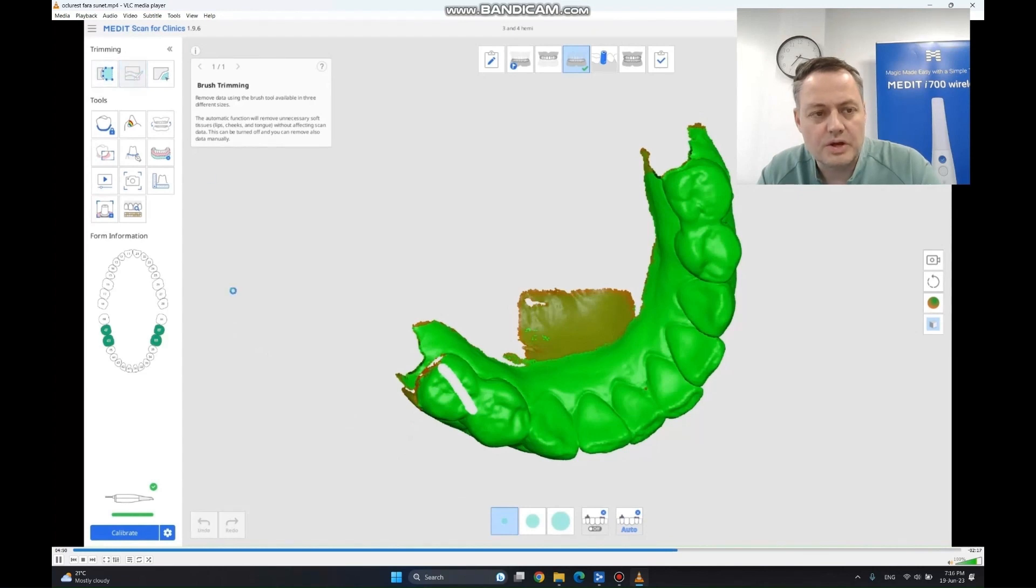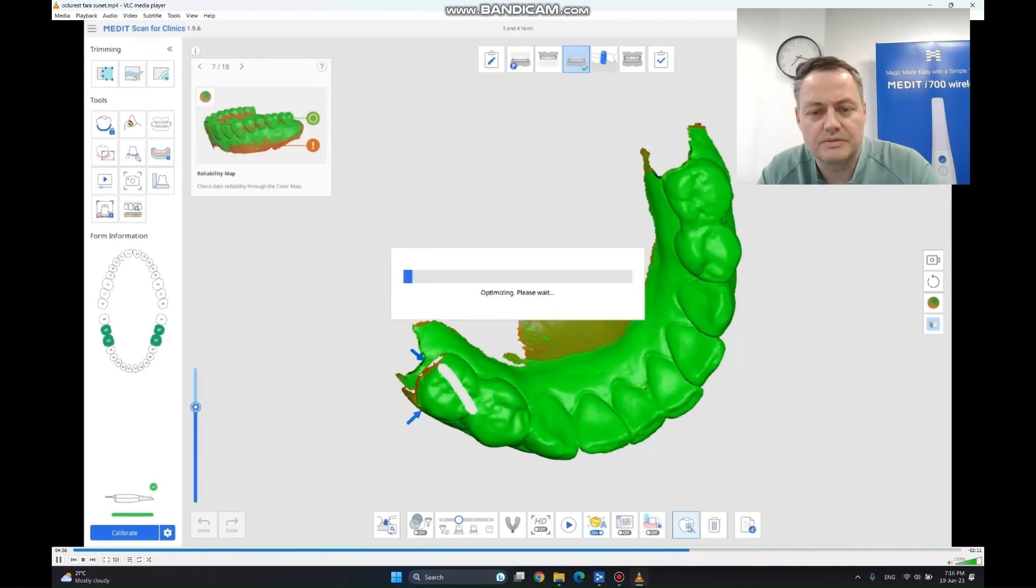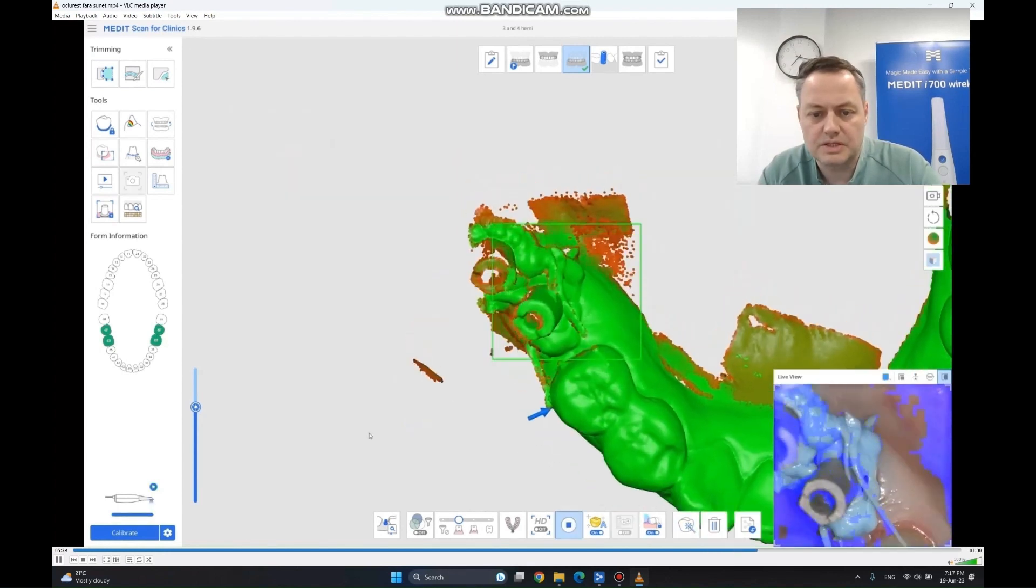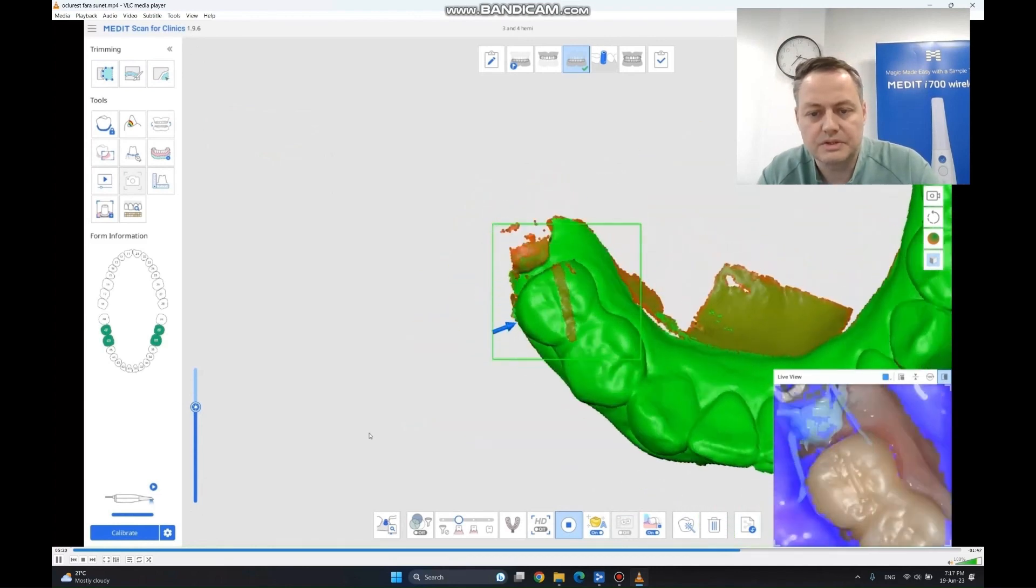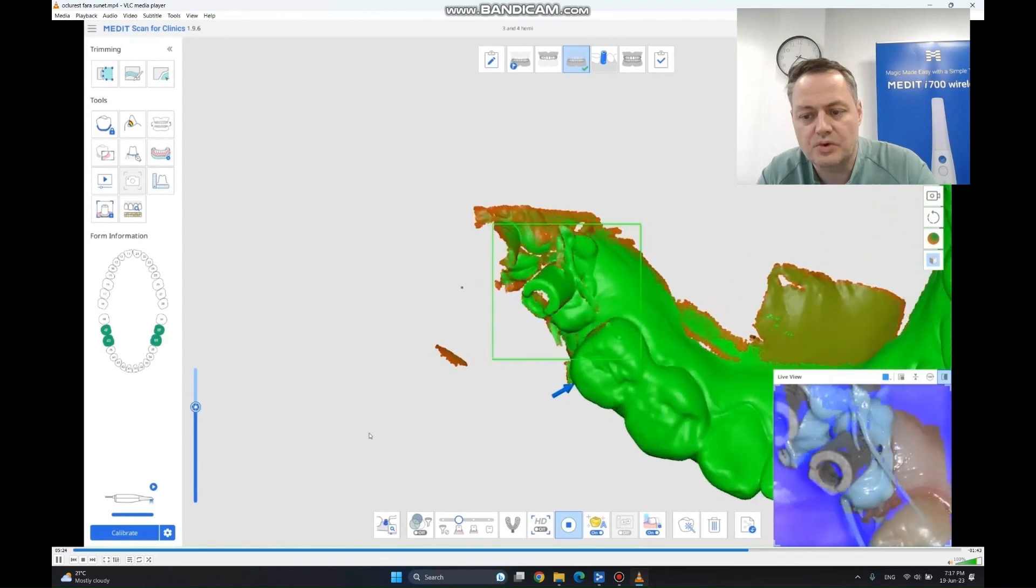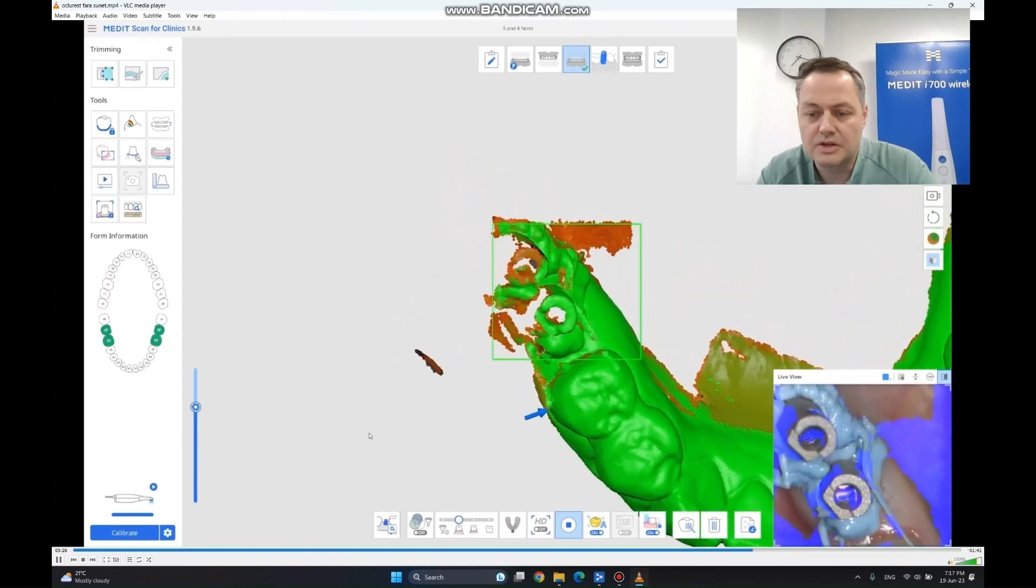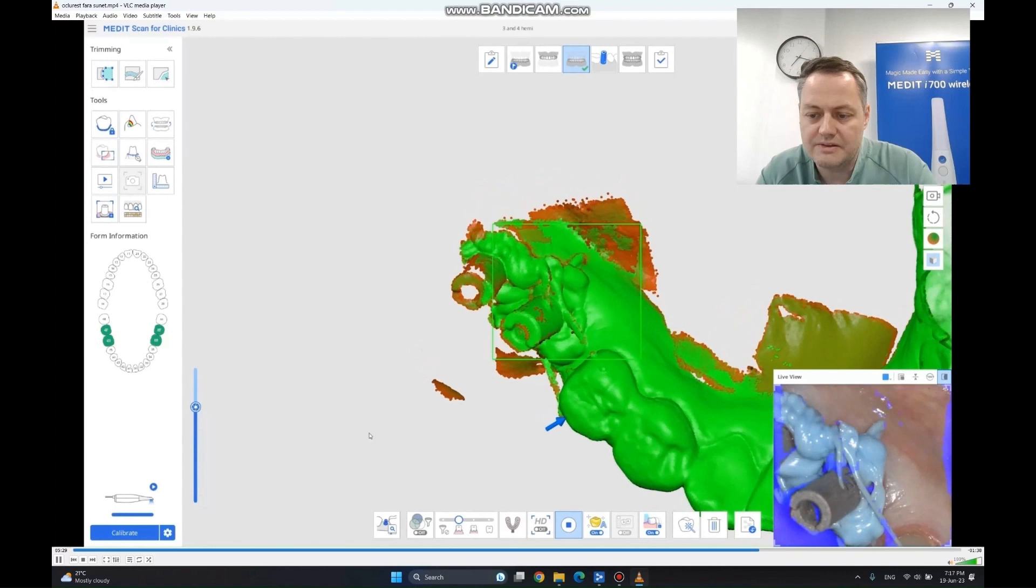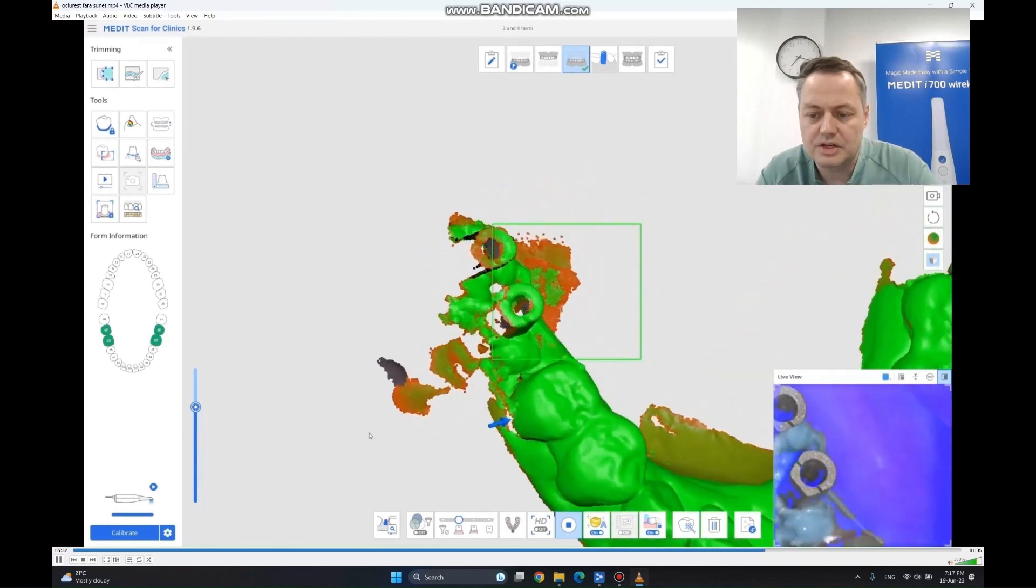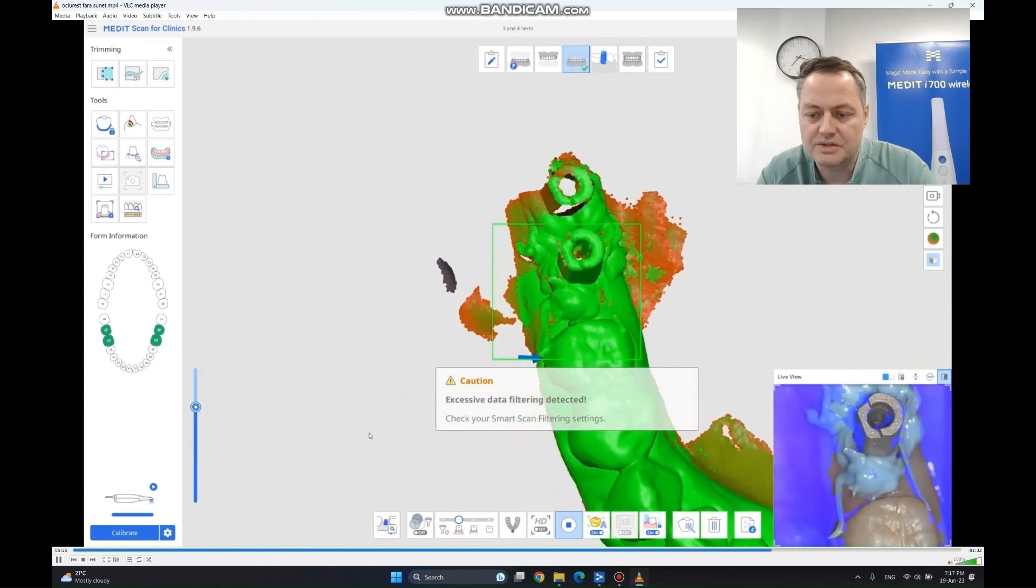Now we are going to complete the missing part before we go forward to the scan bodies. We hit optimize one more time, just to be prepared. And we are going to start scanning right away. As you can see, I completed the missing data. Now I am going forward on every angle to get the scan bodies. You can see in this live case how easy it is to take the impression. It's going very fast. It's hardly even stopping.